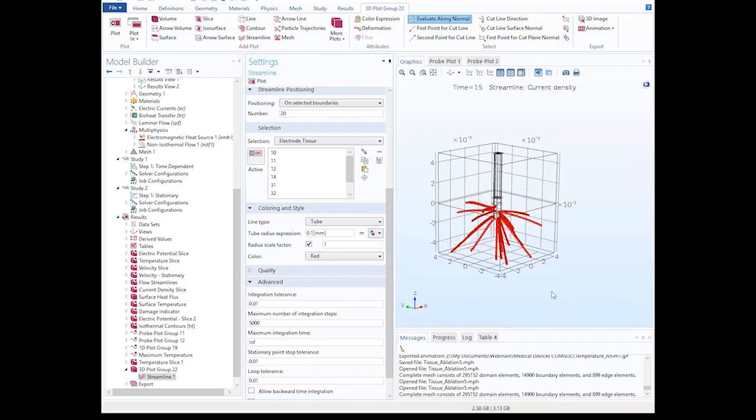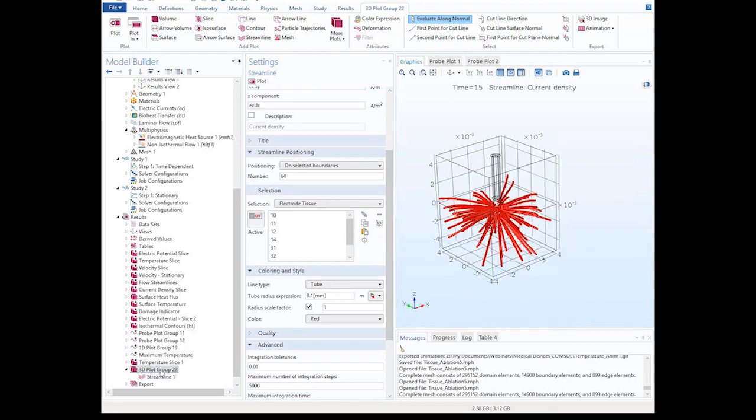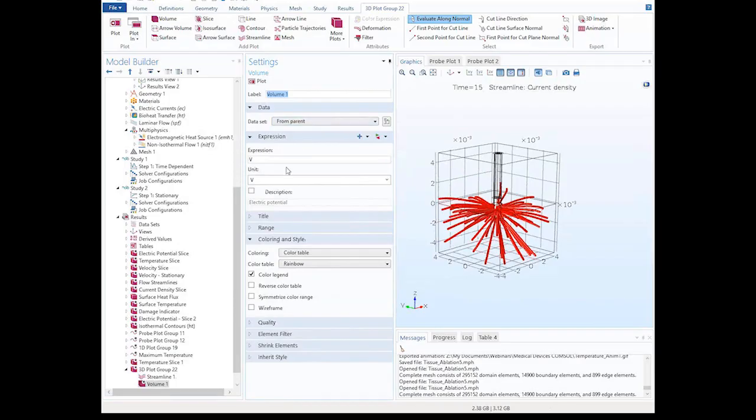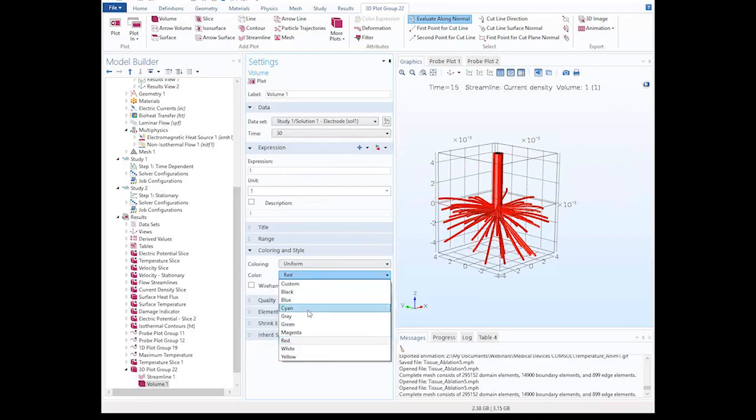So you see the current that starts here is going to spread that way. Let's put like 64 of the streamlines, so it looks better. And that plot would look better if you see the electrode highlighted. So I'm going to plot electrode. I just defined a subset for the electrode, and let's make it not red. Let's make it gray. So it kind of shows a little bit better this way.